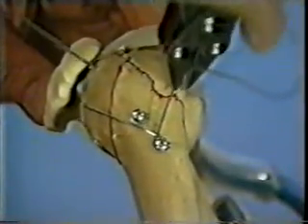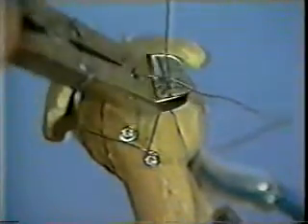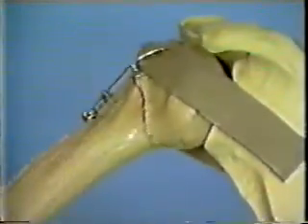The wire may then be tightened with a slight abduction of the arm. The cancellous screw is now driven in fully. The preliminary fixation with the K-wire is retracted. This kind of fixation requires minimal stripping of the bone and provides enough stability to encourage immediate active movement of the shoulder joint.